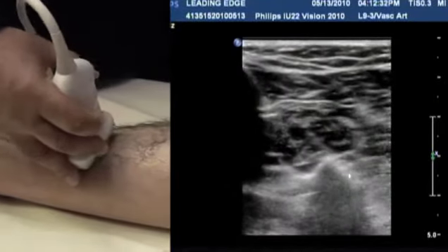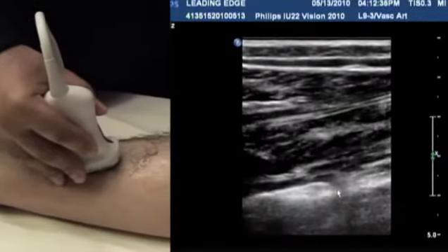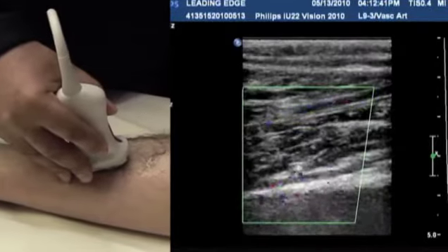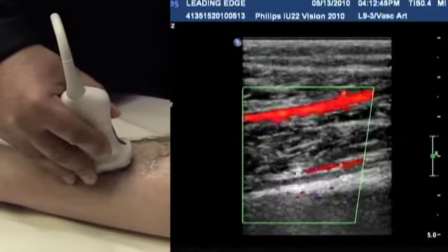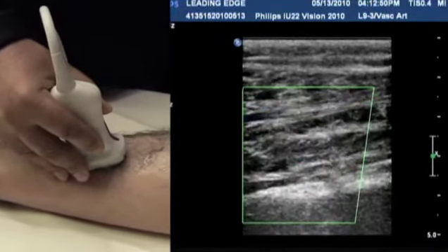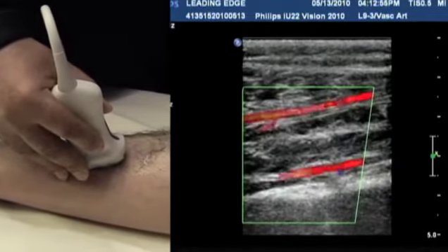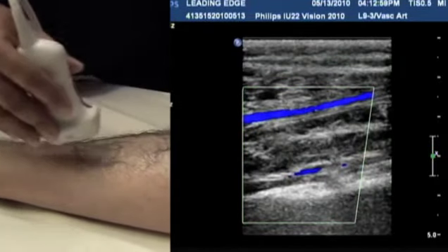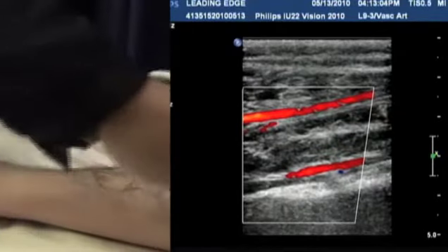The artery is pulsatile. And of course, ultimately, you can always use the color, although keep in mind that in patients with multi-level occlusive disease and with these low flow states, the color may not be very helpful, so the other landmarks might be a little better in terms of identifying the artery. So here they go again. Is your peroneal below or in the far field, and your posterior tibial artery in the near field. And again, you would want to use your color flow image to evaluate the entire length of the posterior tibial and peroneal arteries down to the level of the foot.